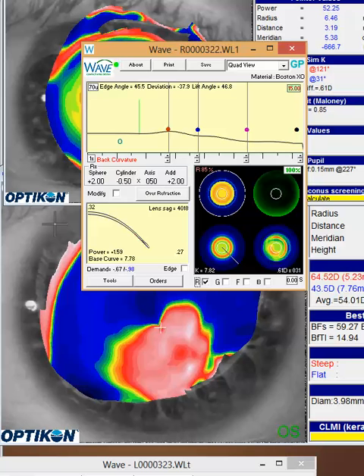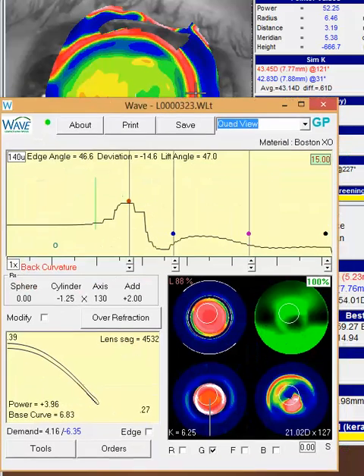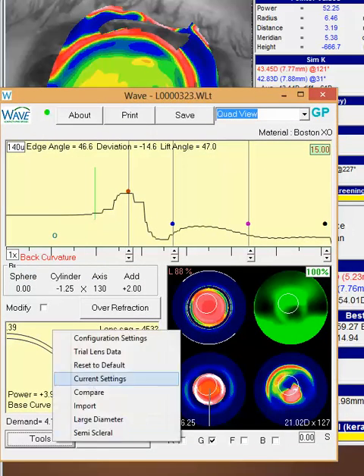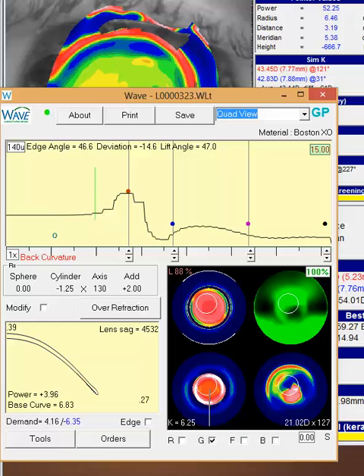Make note of that. Put it back on the eye, on the left eye, and then try to over-refract over there, and then take that data and add it into here, into the trial lens data. At least that gives you some meaningful refractive data that you can put into the lens. And then if you're still having difficulty with it, then you really have to look at the fit. And these will be difficult corneas, but I think if you make those little adjustments, that should get you into the ballpark where you can work with this lens.